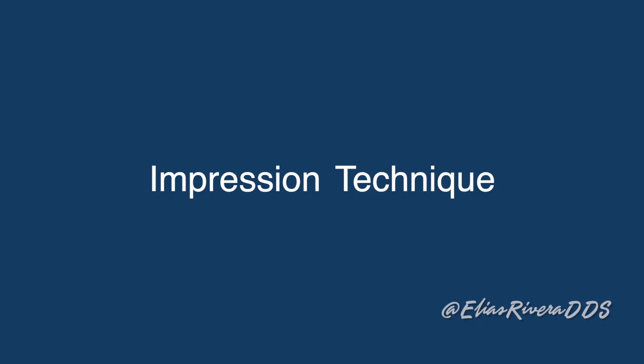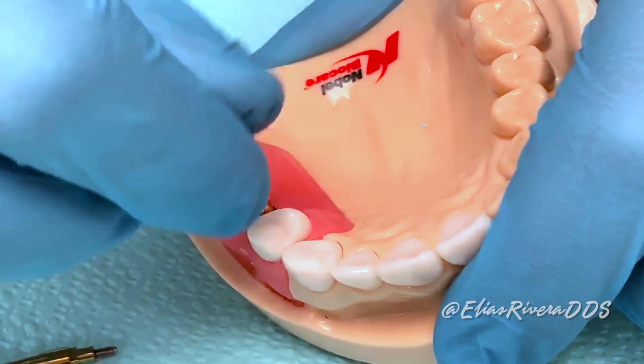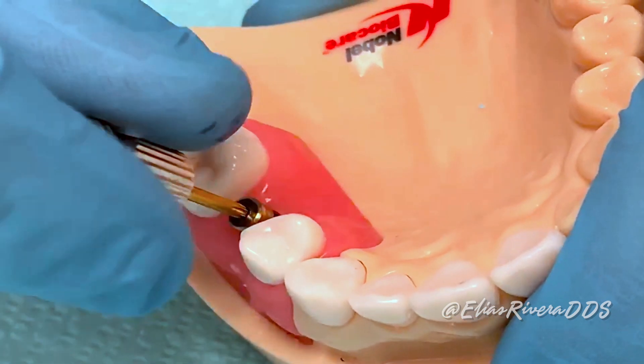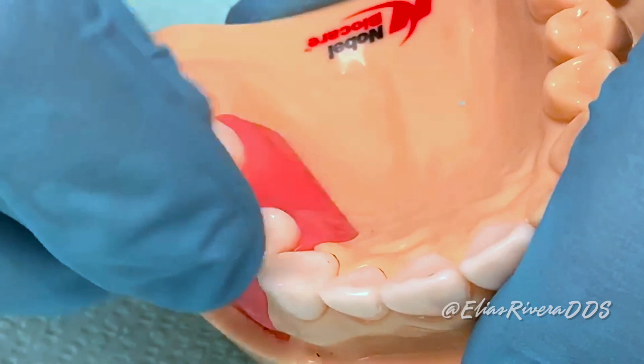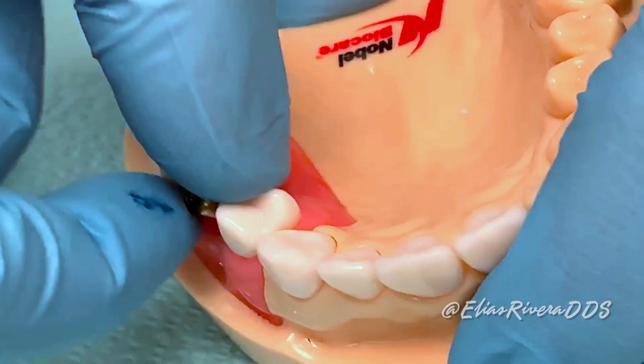Our impression technique will follow six steps. Step number one: remove the healing abutment with the manual screwdriver. This exercise is on a single implant, but please note that in the clinic, if working with multiple implants, remove one healing abutment at a time to place the impression coping.